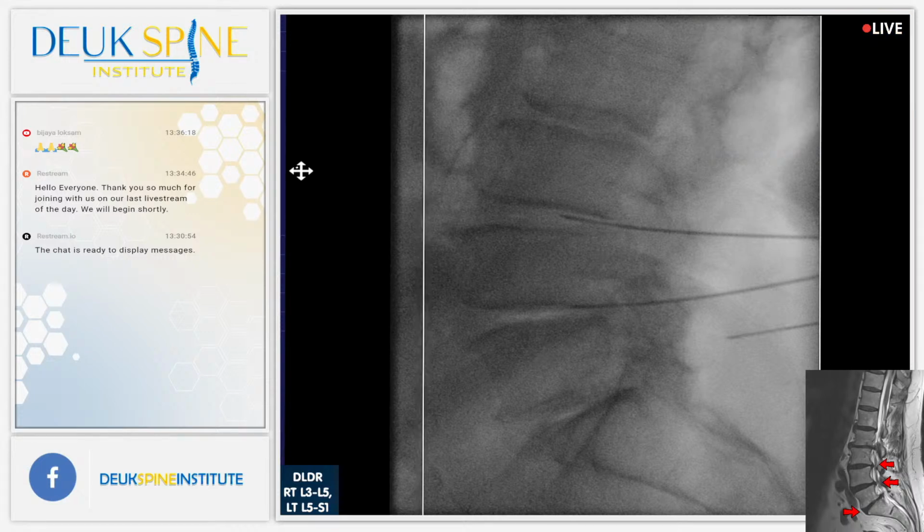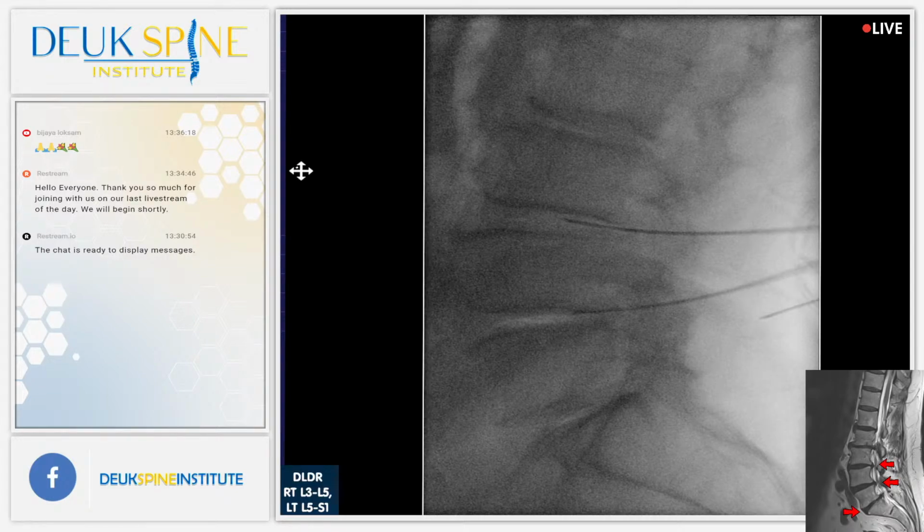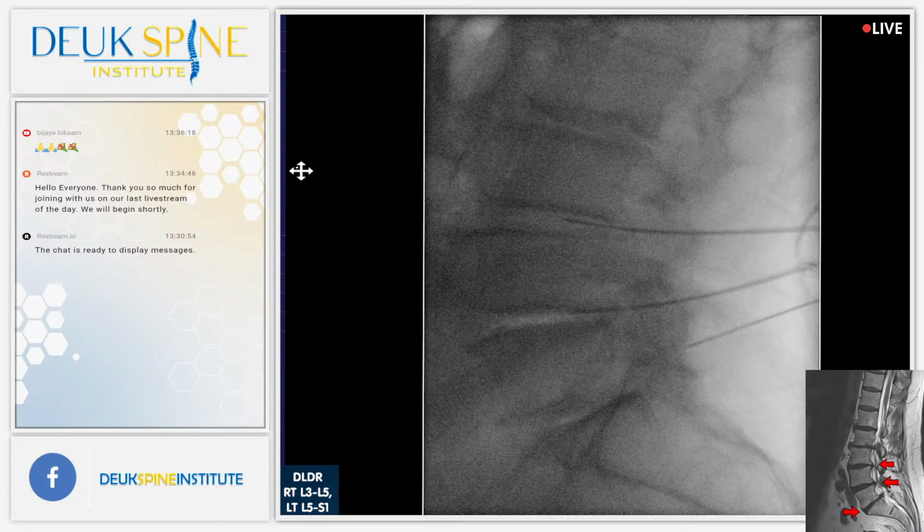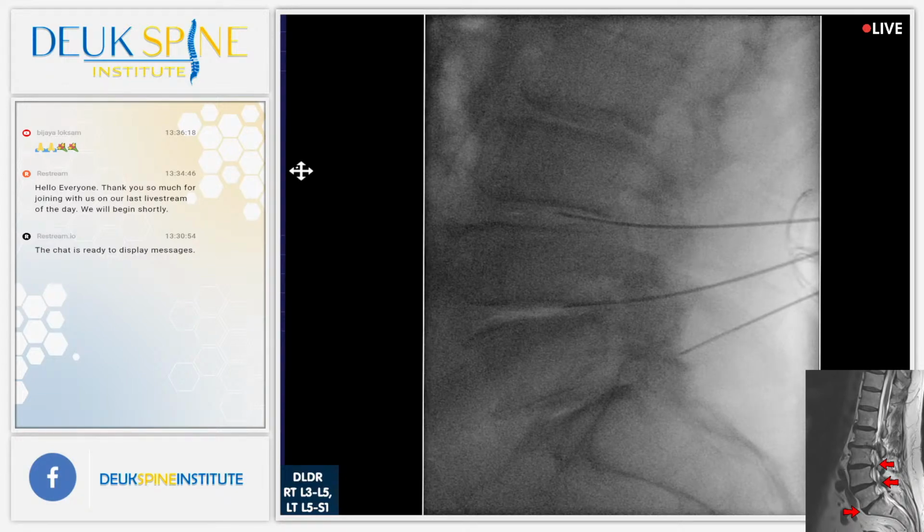All right. On the other side, he's got some scoliosis. It's actually shifted his spine up on this side. Shot. I'm hitting the iliac crest. There we go. Shot. That's looking much better. Heading to 5-1. Shot. Probably a little bit too medial, possibly. Shot. That's looking better. Give me an AP view, please.